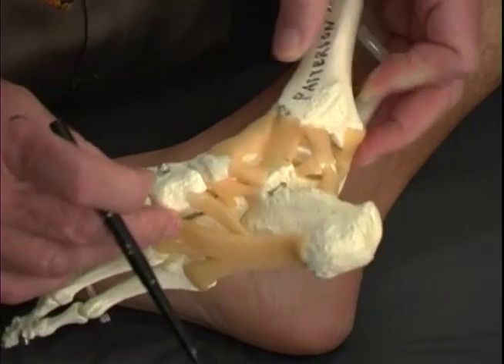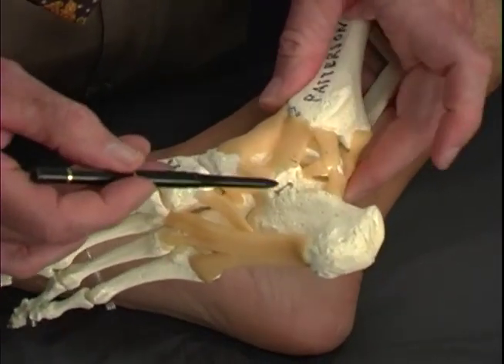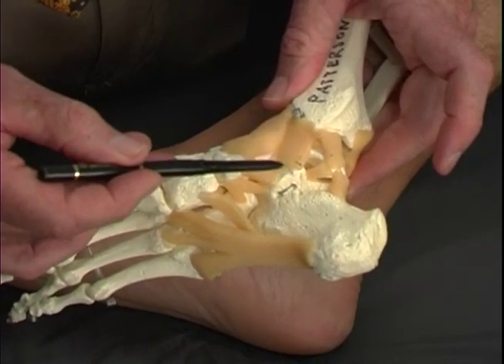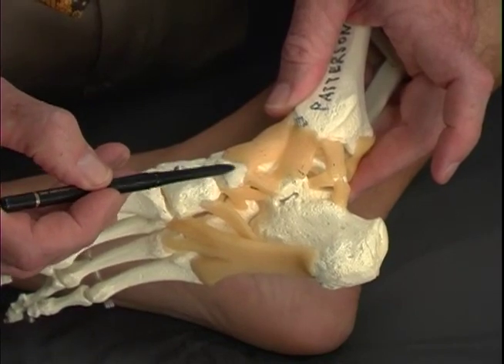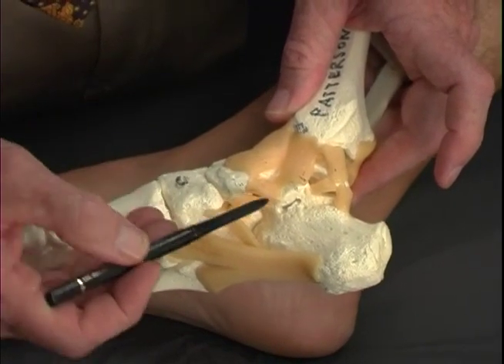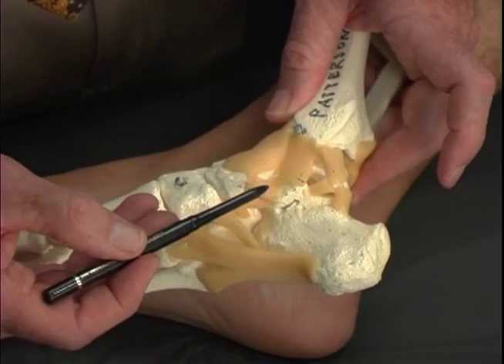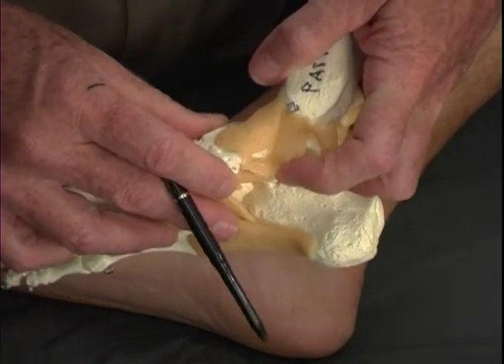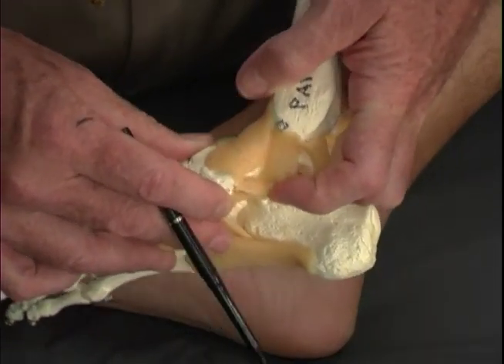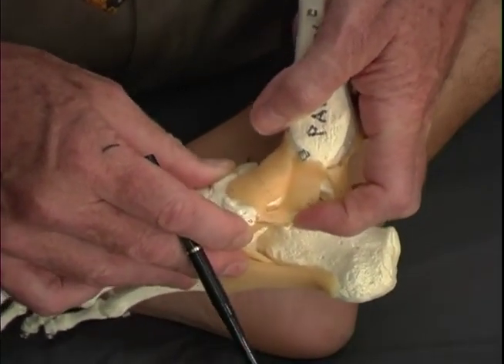We're now turning our attention to the spring ligament coming from the sustentaculum tali right here up to the prominence of the navicular right here. And we can see the spring ligament between those, and it's named the spring ligament for a reason, and that is that every time you step, it's what provides some of the energy to put spring in your step.